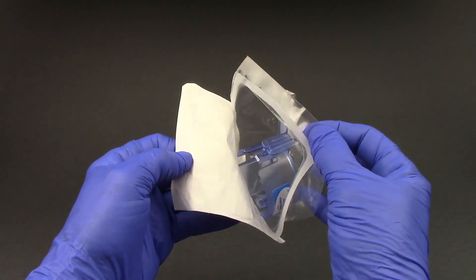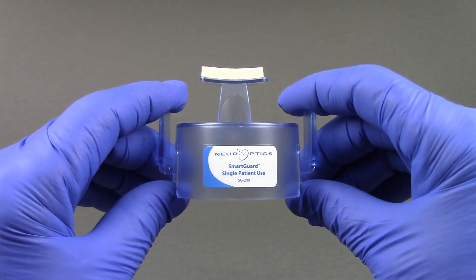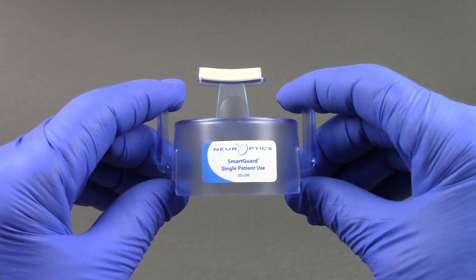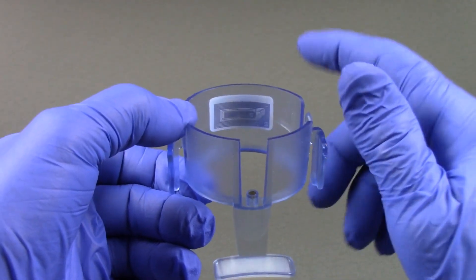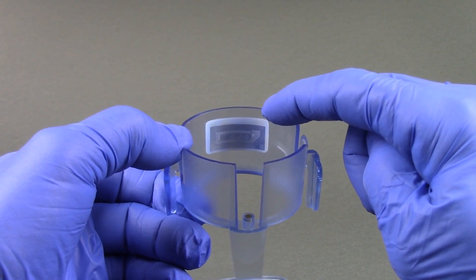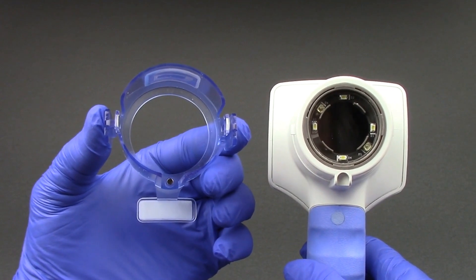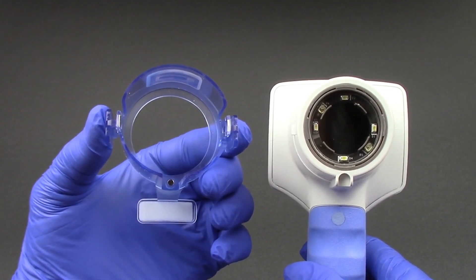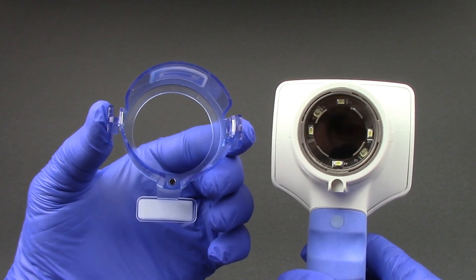Open a new disposable smart guard. The smart guard will be used on the same patient for the length of the patient's admission. The smart guard has an RFID memory tag that stores 168 paired pupil measurements, facilitating upload to the patient's electronic medical record. Attach the patient smart guard to the pupilometer by placing it over the camera lens with the foam pad facing outward at the 6 o'clock position.